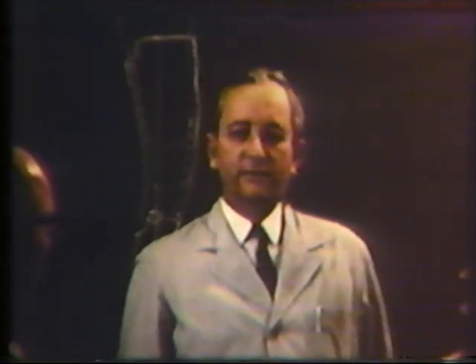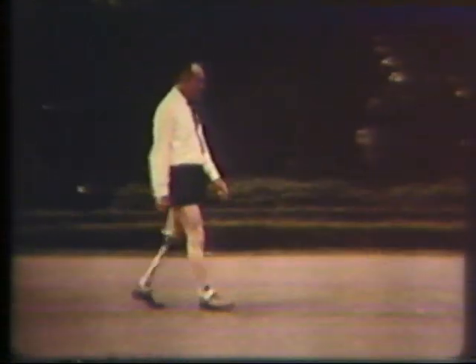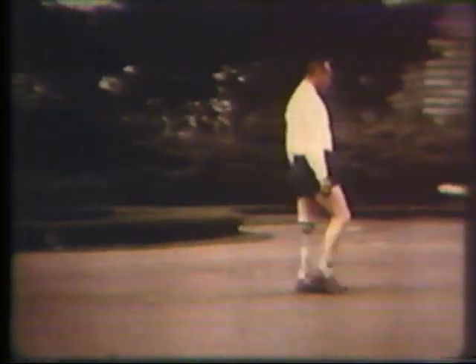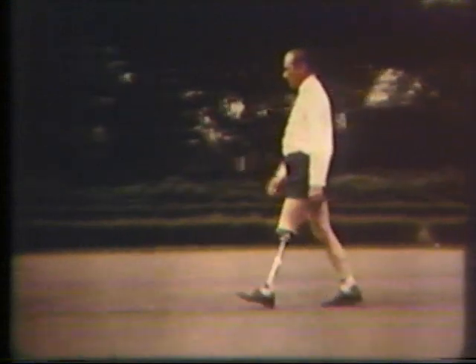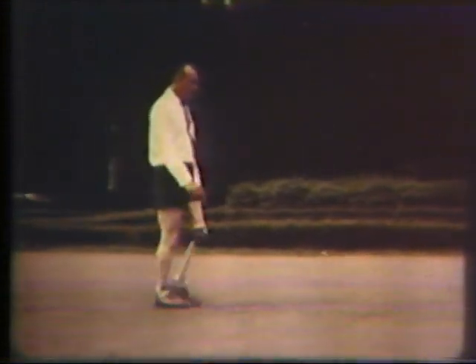Mr. Blair Hanger, associate director and chief prosthetist of Prosthetic Orthotic Education, Northwestern University Medical School. The prosthesis which the subject is wearing is an adjustable one. The length can be varied, the alignment of the knee in all planes can be changed easily, and some characteristics about the foot and ankle can be altered. This adjustable prosthesis is used during the dynamic phase of alignment by the prosthetist.